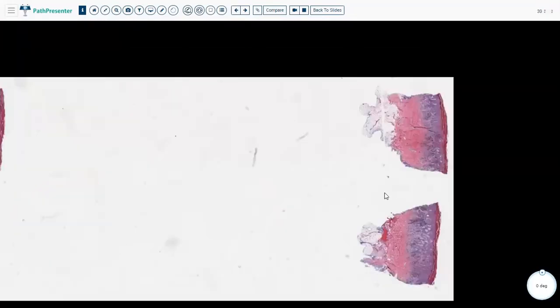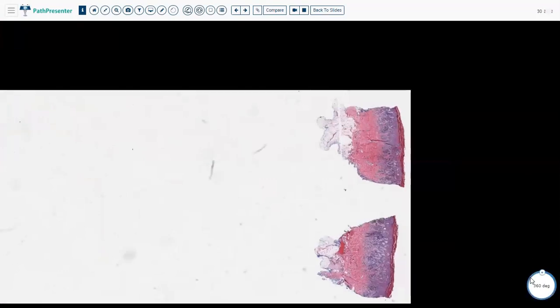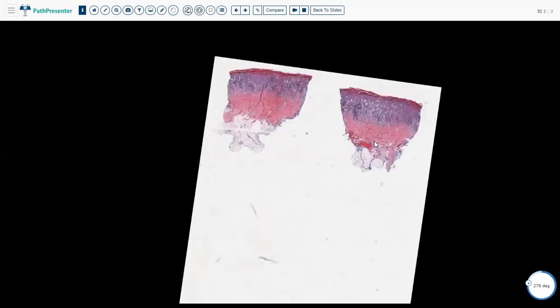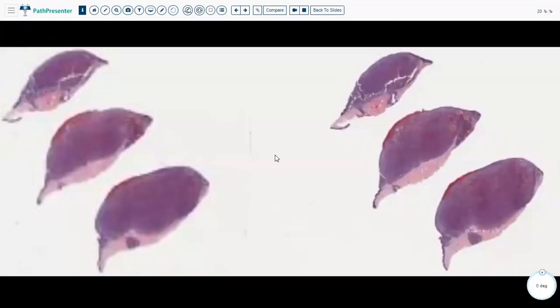Are nodular melanomas just more symmetric? Yes, that's a feature that you usually see in nodular melanomas compared to other melanomas. They are usually very symmetric compared to the rest. So that's why you should not always use one criterion to diagnose a melanoma. Even though symmetry is the most important feature, with nodular melanoma, everything else goes against it being a benign lesion. It's large depth and it's large, if you can see, we go back to nodular melanoma.